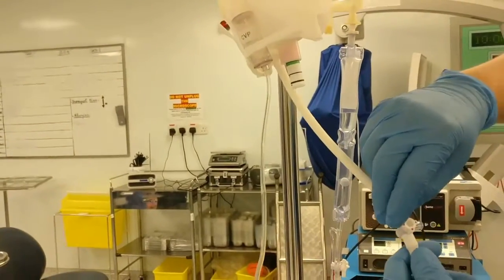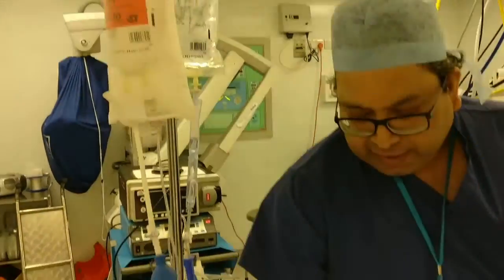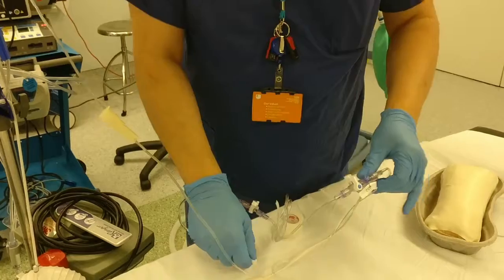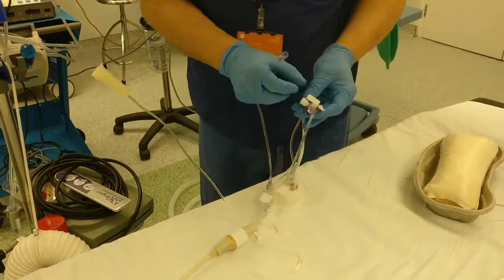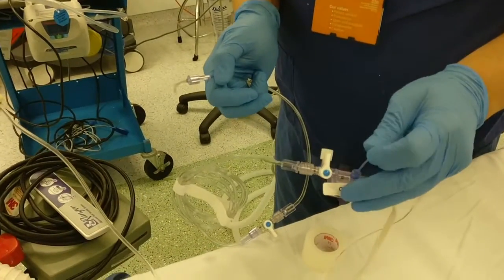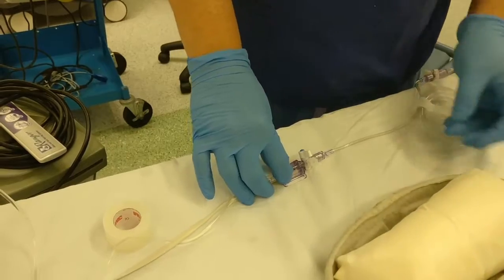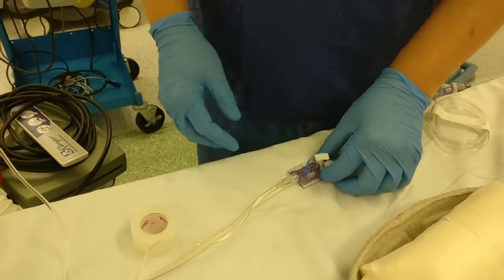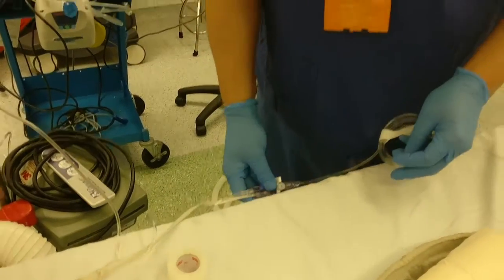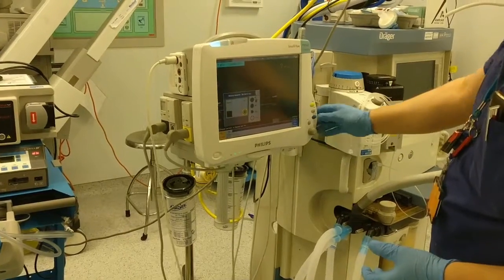At this point, it is important to prime the system, ensuring that all air bubbles are removed by pulling the blue toggle on the transducer to allow saline to flow through. Any air, bubbles or blood may affect the reliability of the pressure reading. The transducer should then be positioned at the same level as the limb in which the compartment pressure will be monitored. Otherwise, artificially high or low values may result.